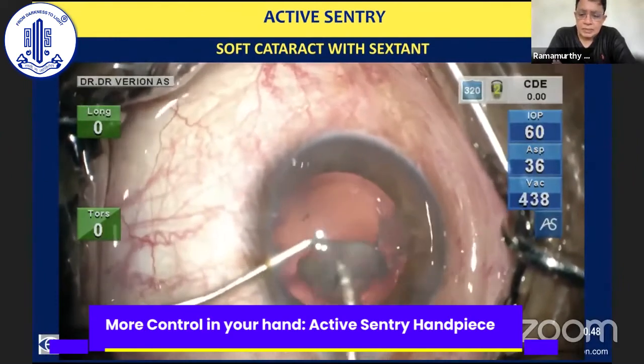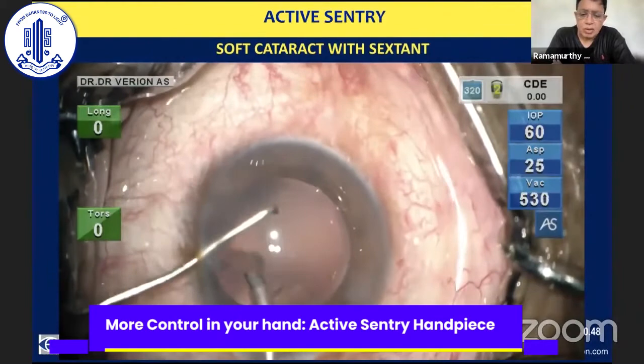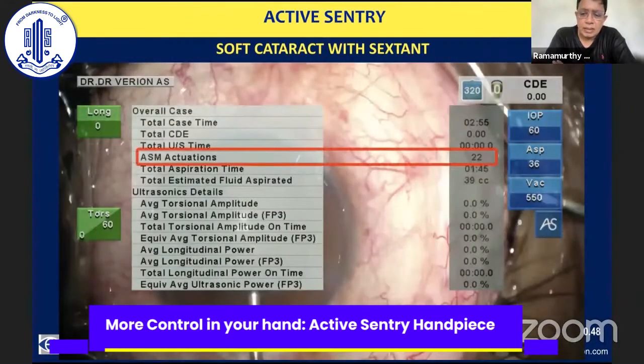And here, I'm surprised that the intraocular pressure is 60, but suffice it to say that most often it's 30. But sometimes when I'm faced with a very shallow anterior chamber, I do raise the intraocular pressure. You can see for a simple cataract like this, with the soft cataract, the number of times the active sentry has been actuated is actually 22. This sounds somewhat counterintuitive, because you think it will be the harder cataracts in which it will be more often used.